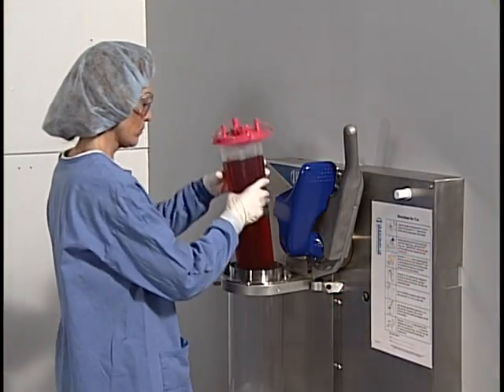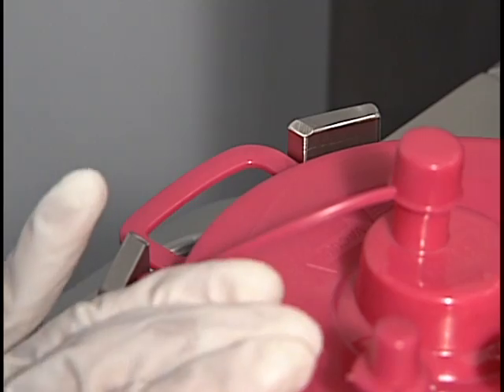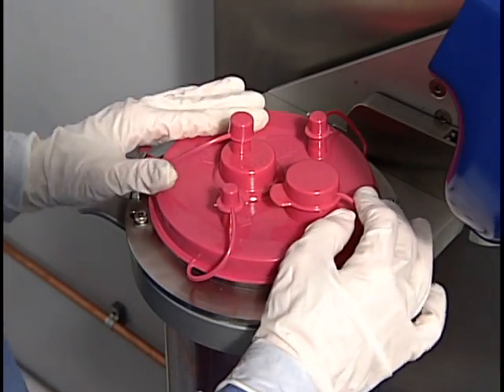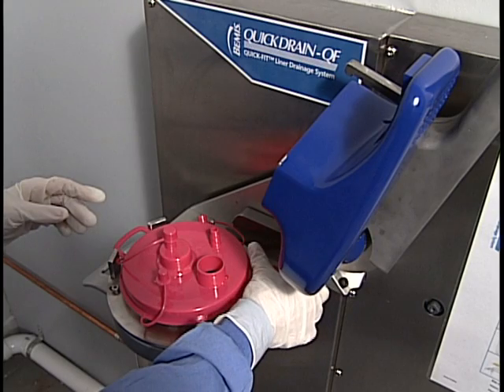Take the filled liner to the quick drain. Put the liner in the canister, making sure to align the handle of the canister between the alignment tabs. Press the liner firmly in place along the entire edge of the canister to get a good seal. Then uncap the patient port and pour spout and place them behind the cap retainers.